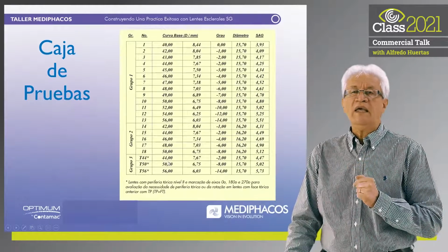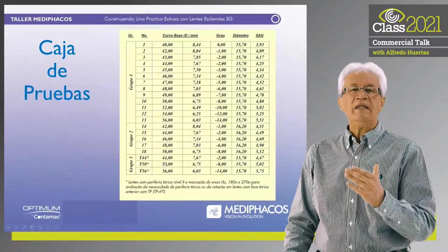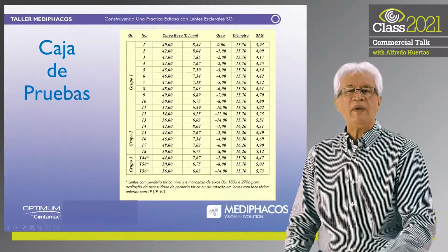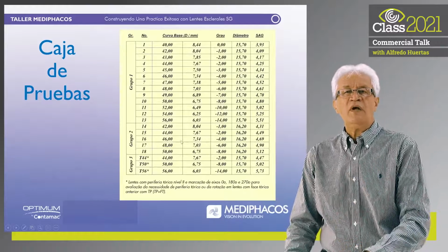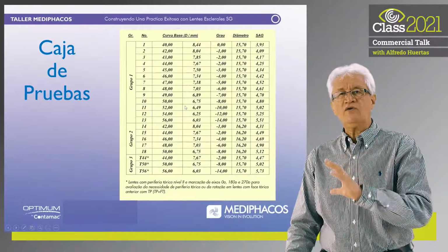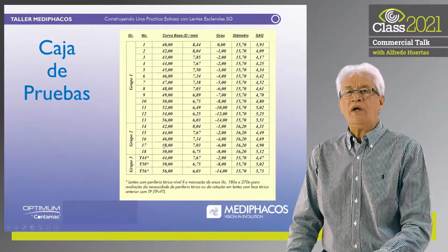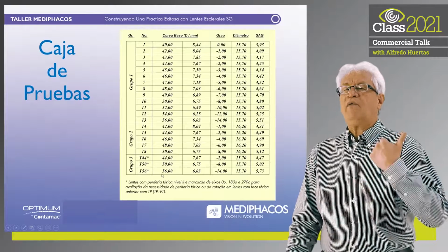These lenses have a posterior toric periphery. That toric periphery helps us manage scleral asymmetry. In this way, when using symmetric lenses, and these are off-center, we can use T44 lenses when we find curvatures up to 44 diopters, from 44 above the T50. If ectasia is higher, we would use the T56.